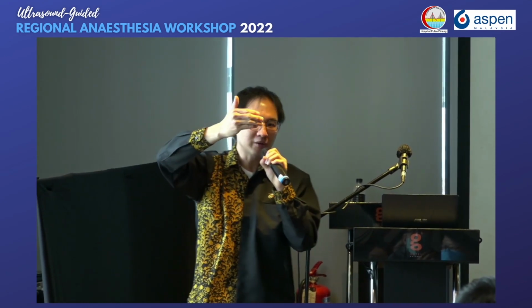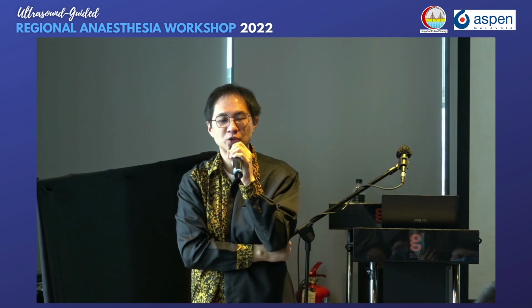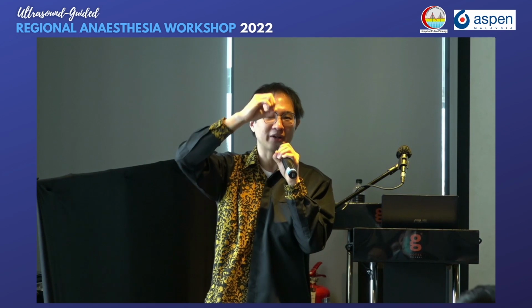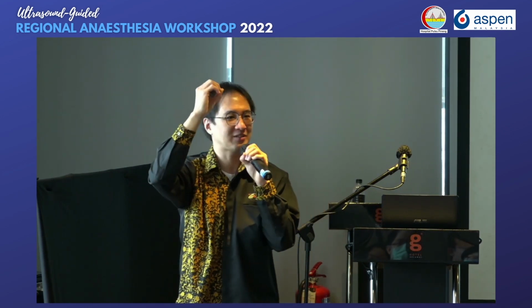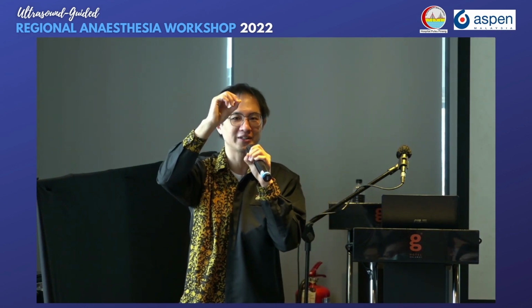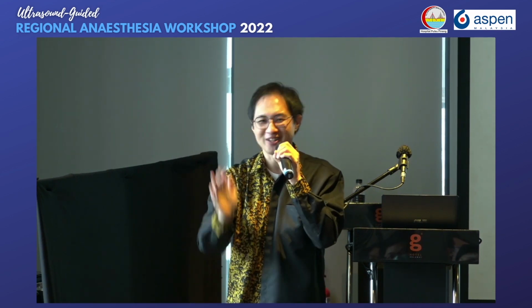After that, you go underneath the biceps femoris and become very, very deep. Once it goes below the biceps femoris, it's very hard to find the nerve. So you try to catch it before it goes into the biceps femoris. That is the technique we use for BKA, not the classical popliteal.